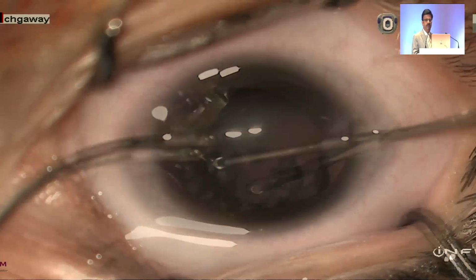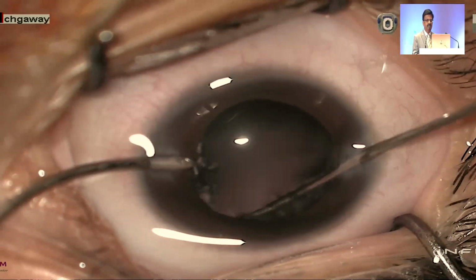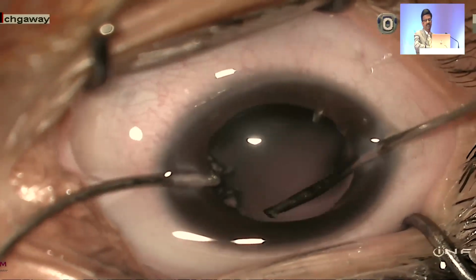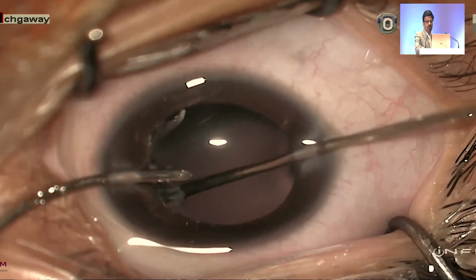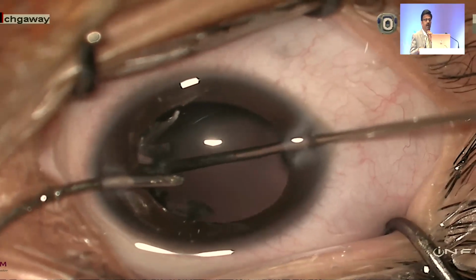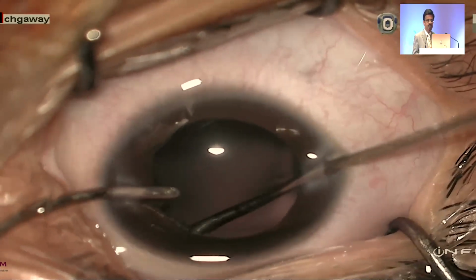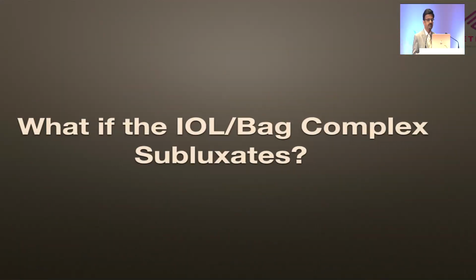So a safer method can be doing a lensectomy and leaving the eye aphakic for a future scleral fixated IOL at an older age. A neatly done lensectomy and good compliance with spectacles after that may give an equally good result. So this is one of the surgical options we have in subluxated lens.